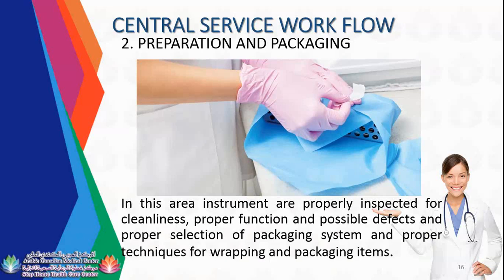In this area, instruments are properly inspected for cleanliness. Check that there is no blood remaining in the crevices of the instrument and no cement on the instrument. You also check for proper function and possible defects, and for proper selection of the packaging system and proper techniques for wrapping and packaging items. We will discuss the proper wrapping and packaging later on, in chapter 16 or 17.